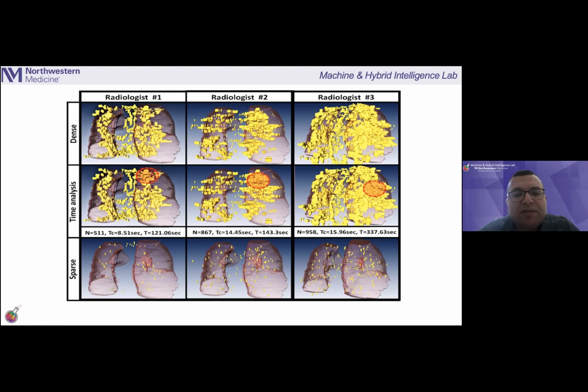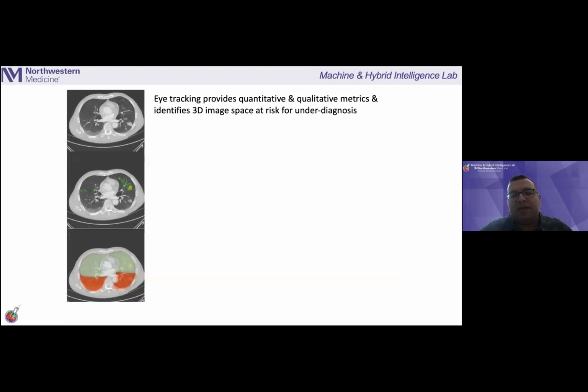The first radiologist actually had more than 20 years of experience. So as time passes and experience increases, the search style is changing and they are becoming faster. And for the algorithm, we don't really have any constraint on this. The only input is the biological attention after sparsification.